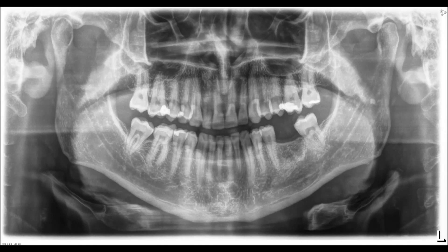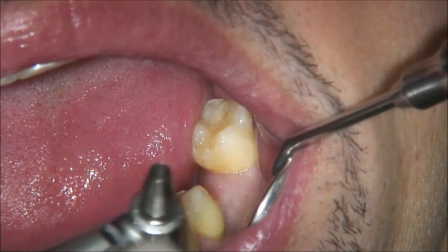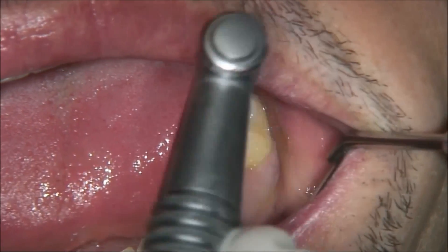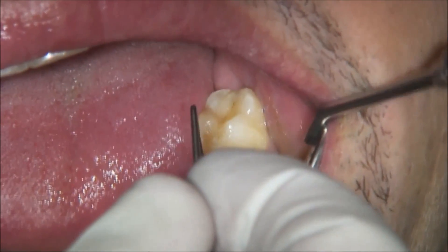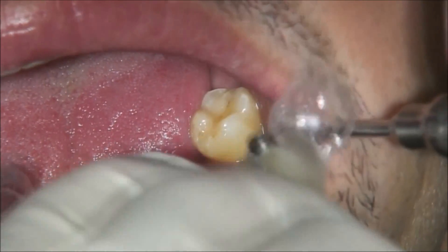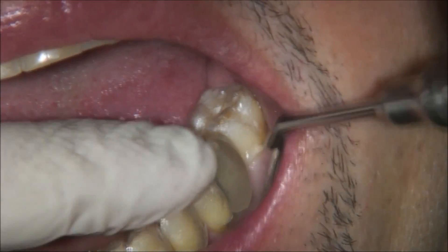Hello, everyone. In cases of adequate gingiva and enough bone quantity, we use the soft tissue punch. We remove the soft tissue on top of the implant insertion site. We measure the thickness of the soft tissue — we have 3 mm soft tissue thickness.